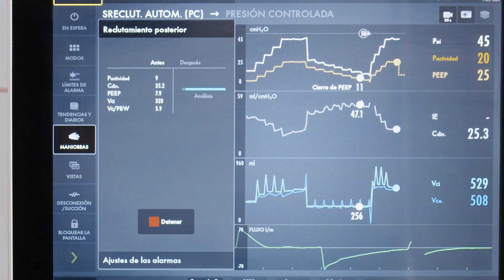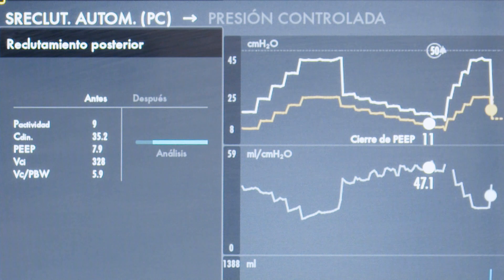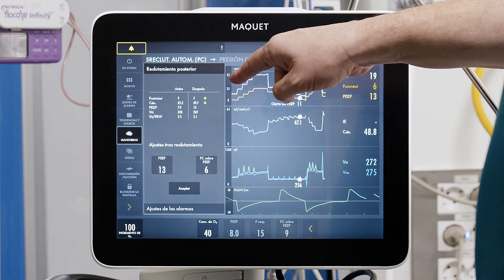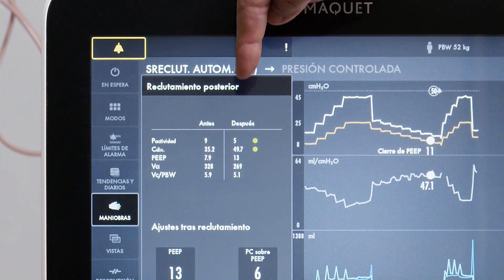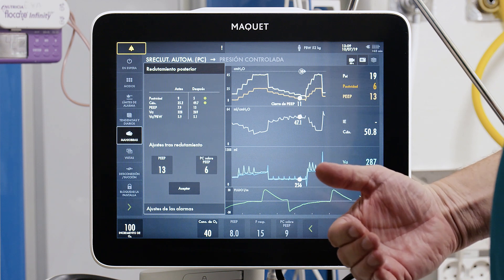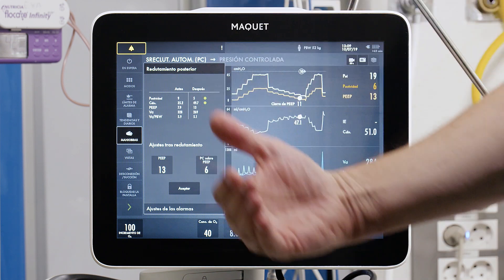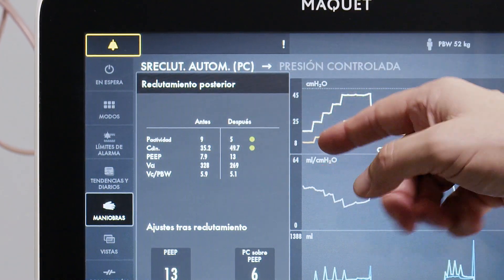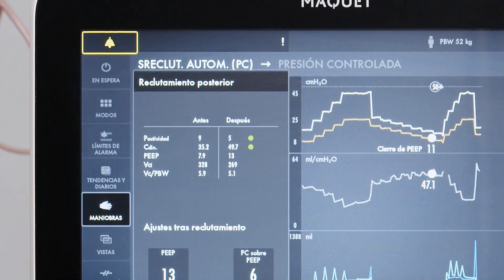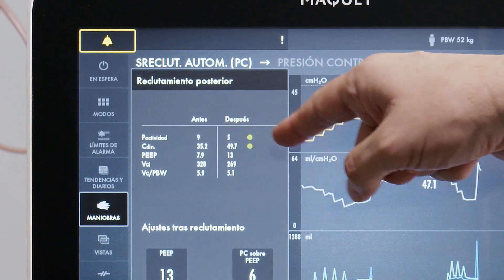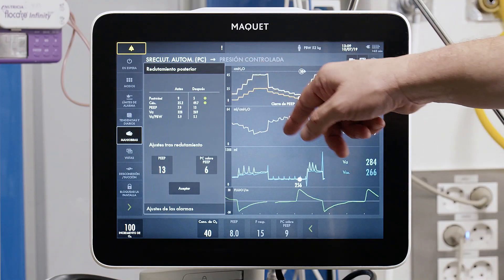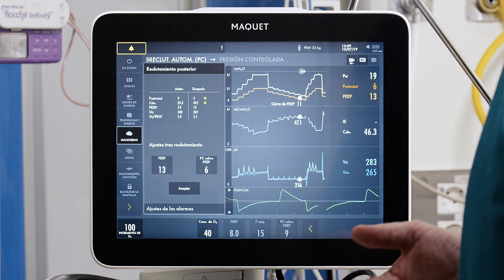After identifying the point of maximum compliance — the closing pressure of the lung — the system shows a comparison from before and after recruitment. Driving pressure decreased by 4 cmH2O. Compliance increased from 35 to 49.7, a major improvement, which explains the reduction in driving pressure. The recommended PEEP level is now 13 cmH2O instead of the previous 8 cmH2O. Tidal volume differs slightly because 5 mL per kilogram was used during the PEEP decremental trial, a difference of 1 mL per kilogram predicted body weight.